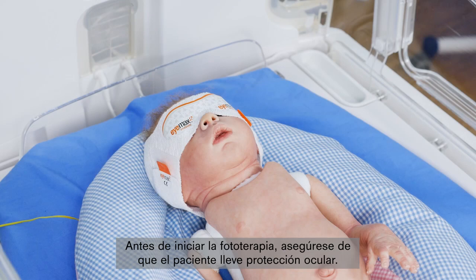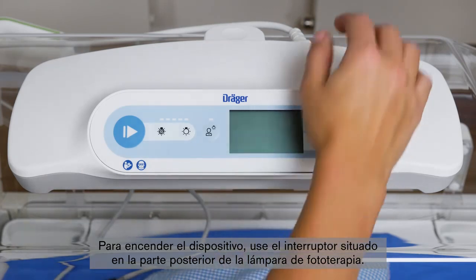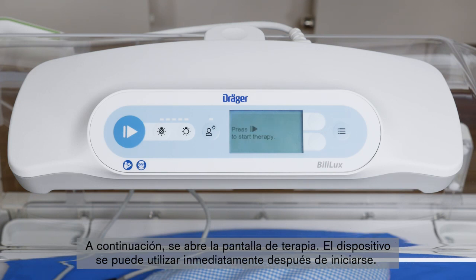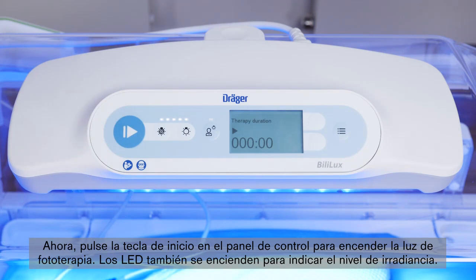Before you start the phototherapy, make sure that the patient's eyes are protected by eyeshields. To switch on the device, use the on-off switch located on the rear of the phototherapy light. The screen briefly shows the start-up screen, which contains the Bililux firmware version and the current date and time. The screen then proceeds to the therapy screen. The device is ready for use immediately after start-up. Now press the start key on the control panel to turn on the phototherapy light. The LED indicators also turn on to indicate the irradiance level.